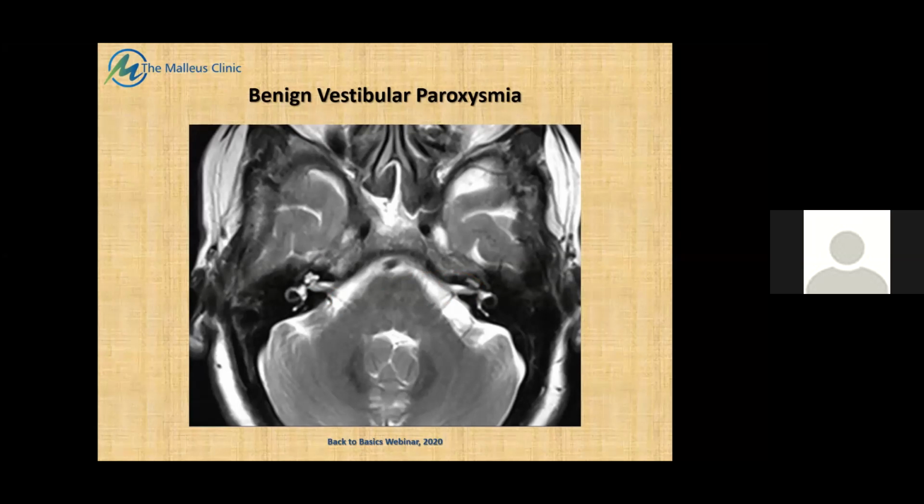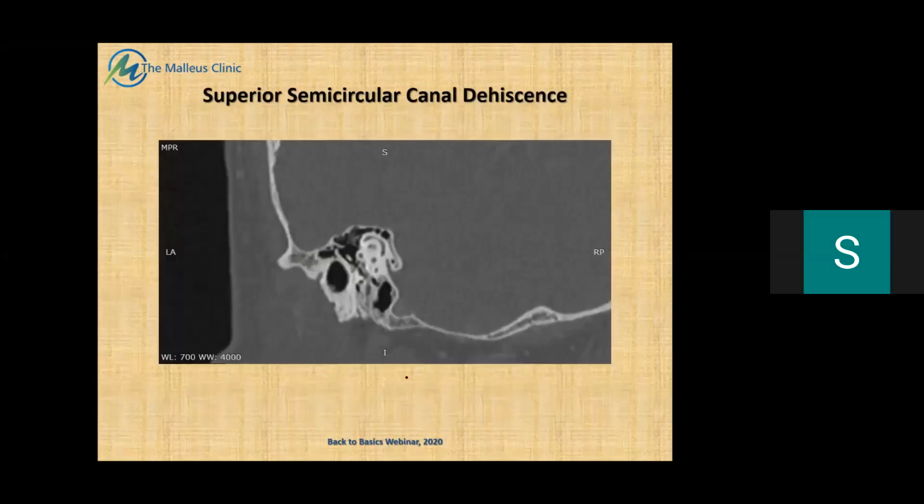But the dilemma here is, in case it's not very clear which side is the neurovascular cross compression, then in cases where there is a bilateral vascular loop, it's very difficult for the clinician to decide which side of the patient should be subjected to the microvascular decompression.